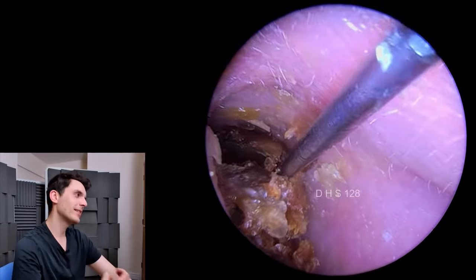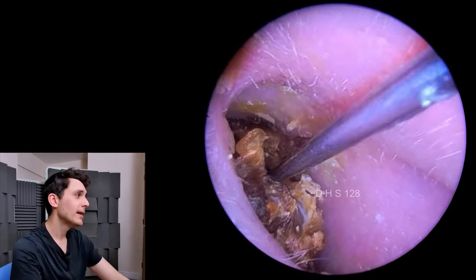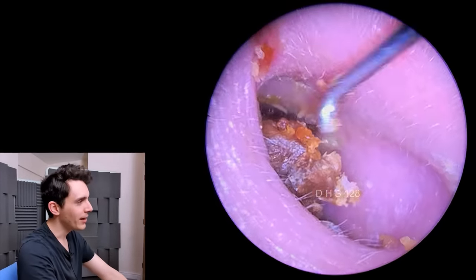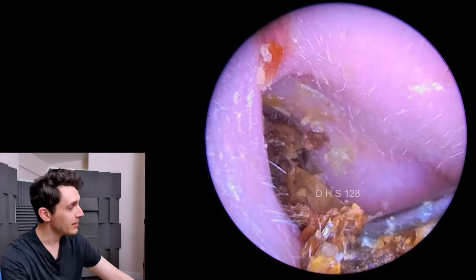This particular patient presented to the clinic with hearing loss, slight discomfort and a feeling of fullness in the ear, which you would expect. And very little of it is wax — it's basically sheets and folds of dead skin packed, packed, packed into the ear canal.